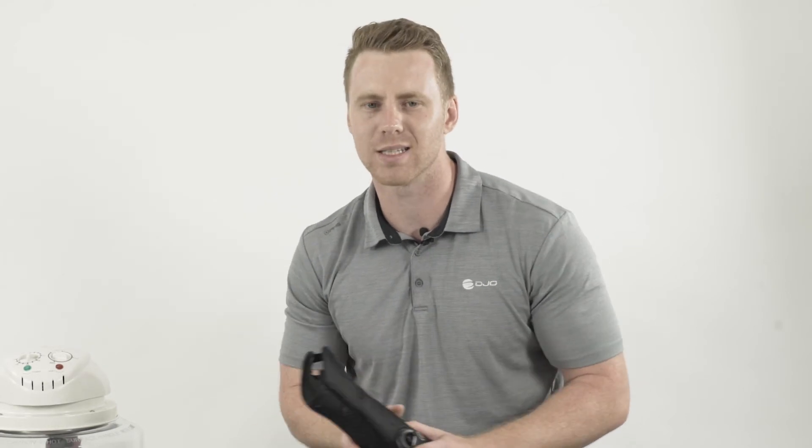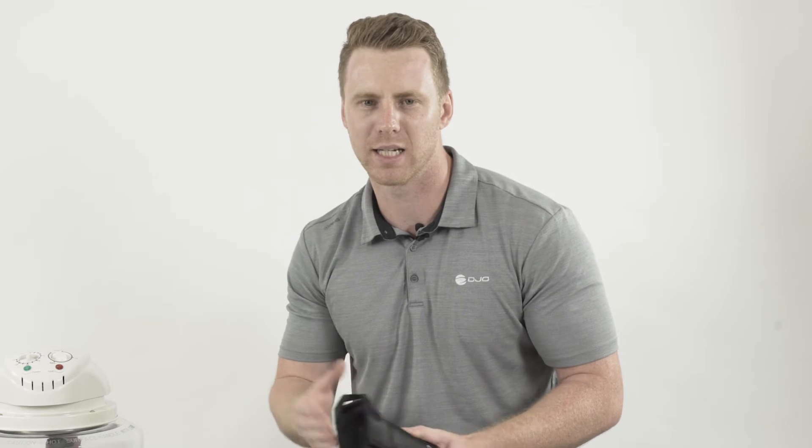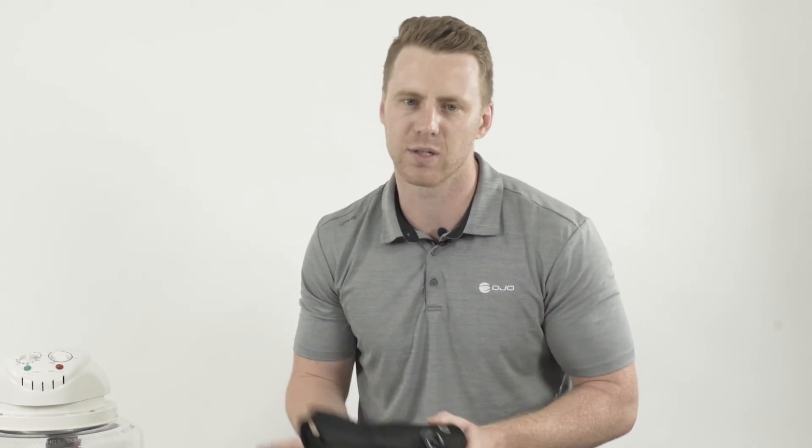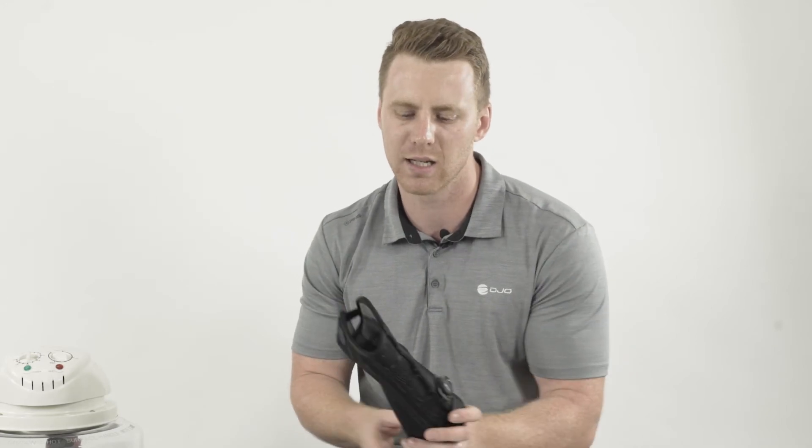A common question we get asked with any new product is how it compares in terms of stability versus a traditional plaster cast. We've recently released a biomechanical study which shows that for a stable distal radius fracture, the Exos short arm fracture brace provides the same equivalent level of immobilization as a traditional plaster cast.